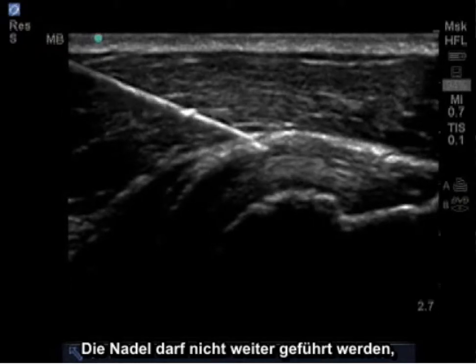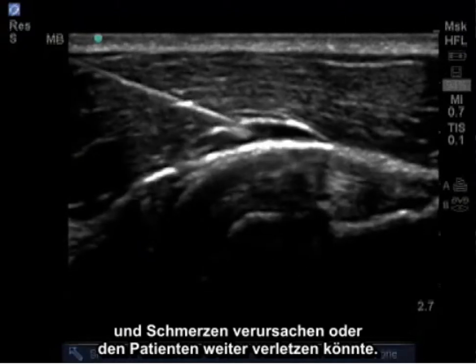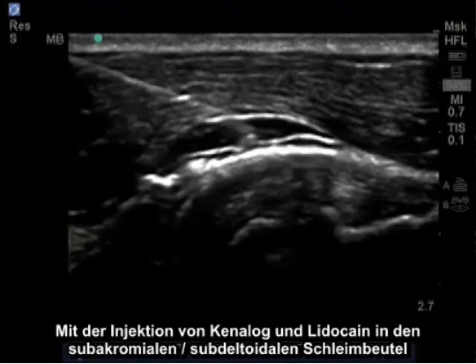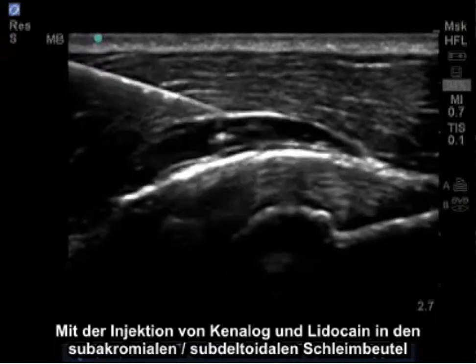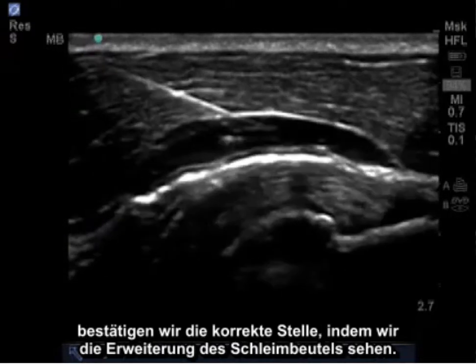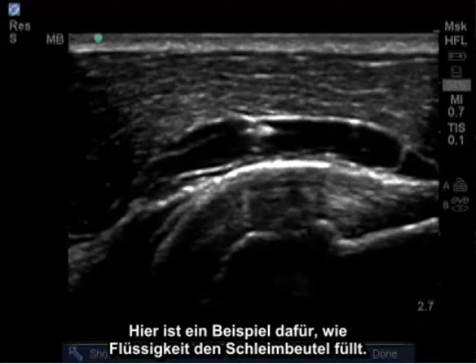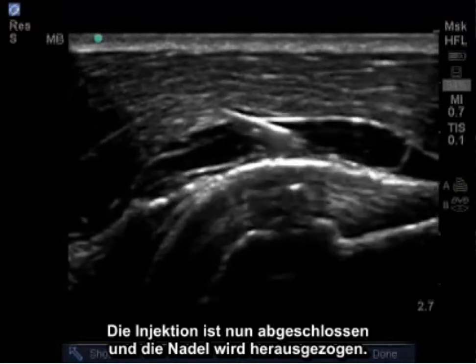It's important not to continue needle penetration as this may penetrate the supraspinatus tendon and may cause pain as well as eventual further injury to the patient. With injection of kenalog and lidocaine into the subacromial subdeltoid bursa, we confirm proper location by seeing expansion of the bursa. Here is an example of fluid filling the bursa. The injection is now complete and the needle is withdrawn.